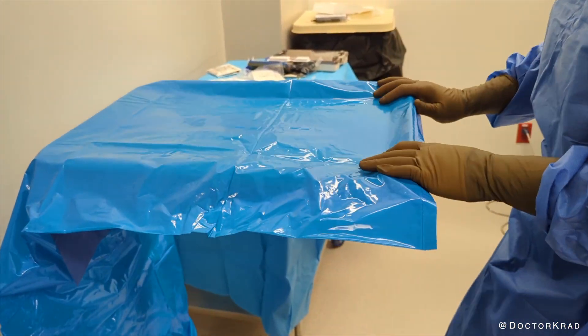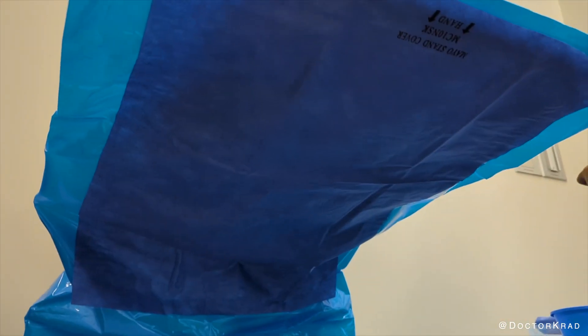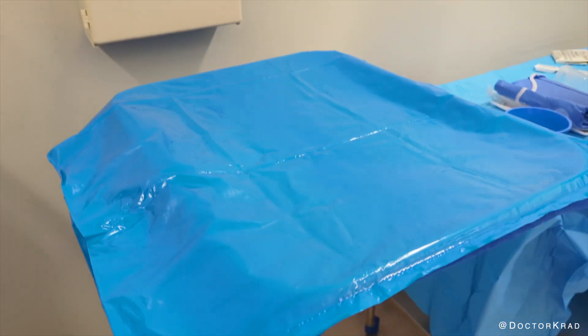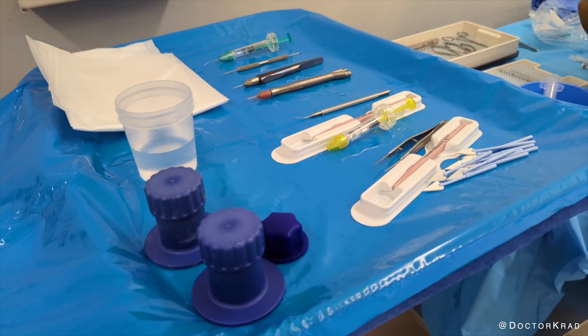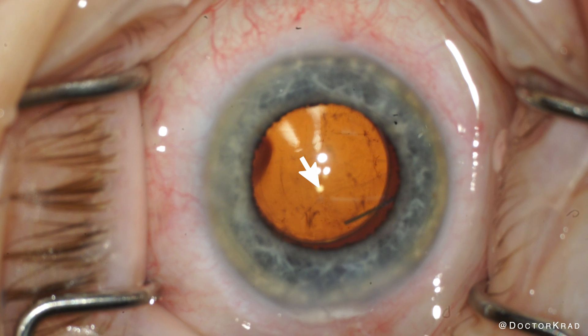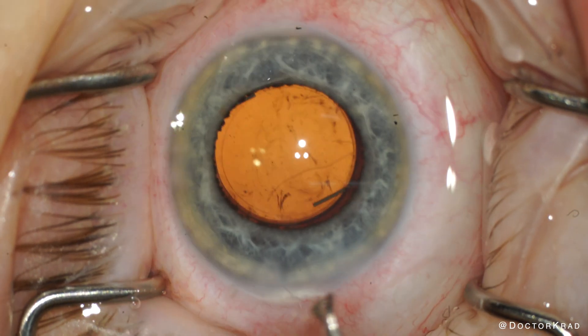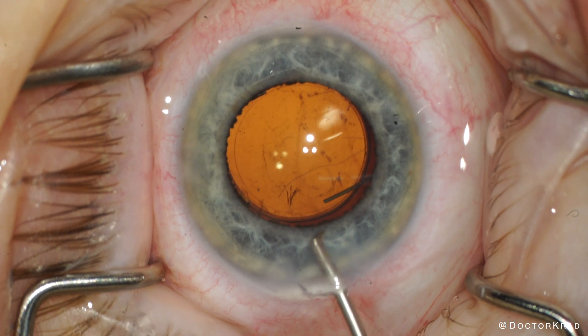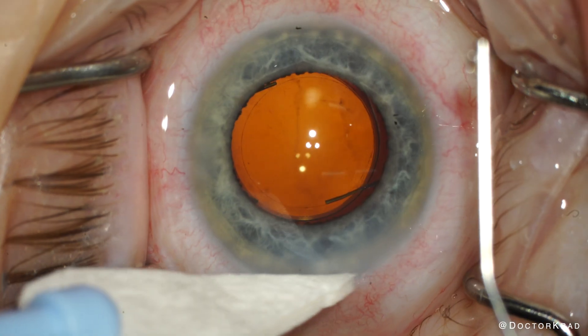One way to minimize the fibers on your surgical field is to turn the Mayo stand cover around. This polyethylene side won't deposit any fibers on your instruments. Keep in mind this side is more slippery and isn't reinforced with the extra SMS, so be careful not to puncture it — but that is easy to avoid. And of course, be watchful and remove any visible fibers from your instruments so they don't get into the eye.